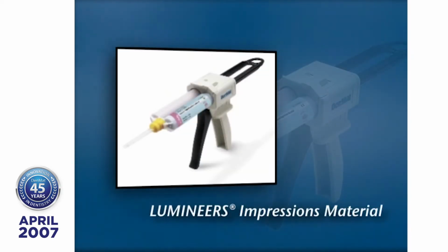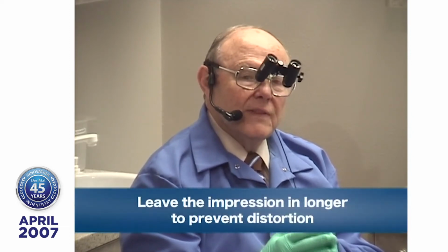Now, in order to do this and get a good result, you're going to have to use a good impression. And so we recommend the Lumineers impression material, get sharp feather edges, we don't retract the tissue, and you should really pour a model before you dismiss your patient because you want to check those margins to be sure you're satisfied with them. All too often when they come into the laboratory, sometimes there will be a margin that's faded out and it's not visible. We have to call the dentist and tell them that you need to take another impression.